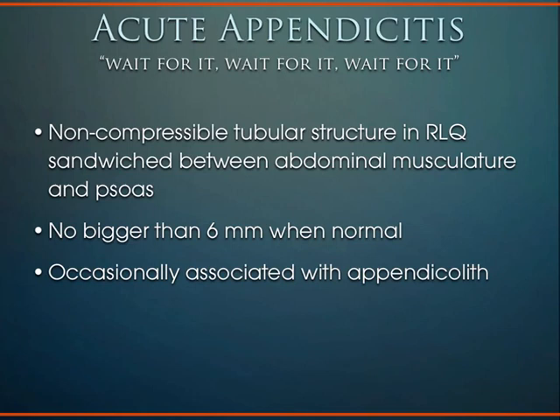So we typically use a very short-acting narcotic like fentanyl, lasts for about 20 minutes. We give the patient a good slug of fentanyl, 1 to 2 micrograms per kilogram, and it's a very potent analgesic, and when given, works almost immediately and gives you a little window there in which to compress the abdomen. And so a normal appendix should not be more than 6 millimeters.